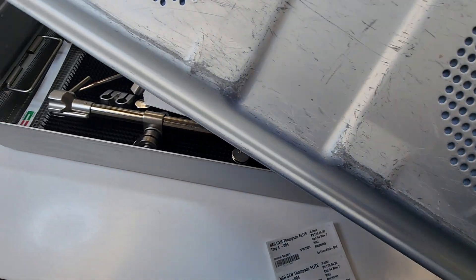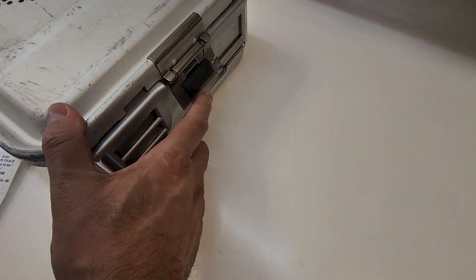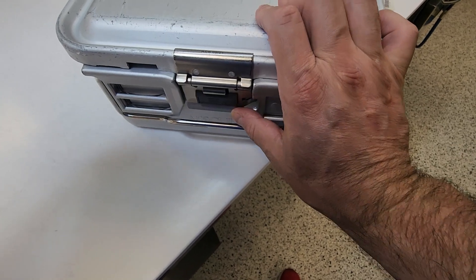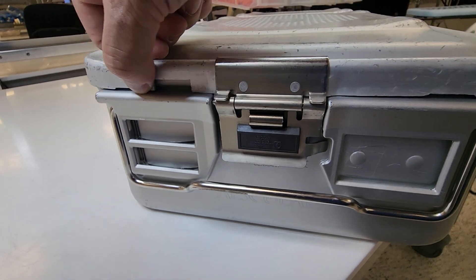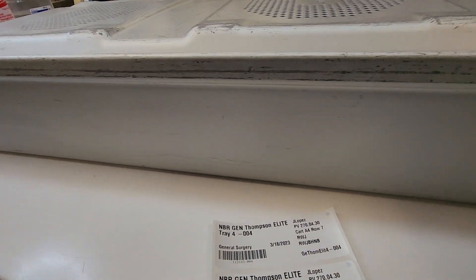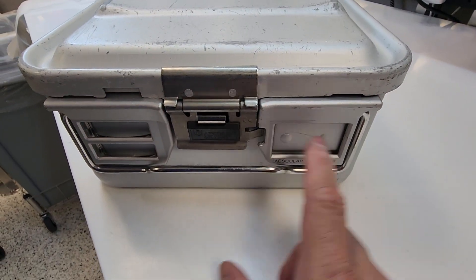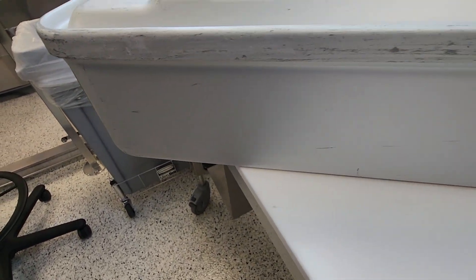Now, when we place our lid on, you want to ensure that your lid latch is locked. One click. Two clicks. What are we looking for? We are looking for an even seal between the lid and the basket, all the way around. On the other side, same thing — an even seal and even lock all the way around the basket.